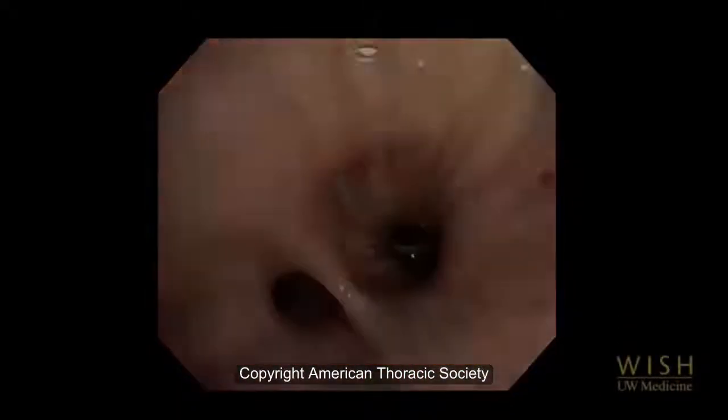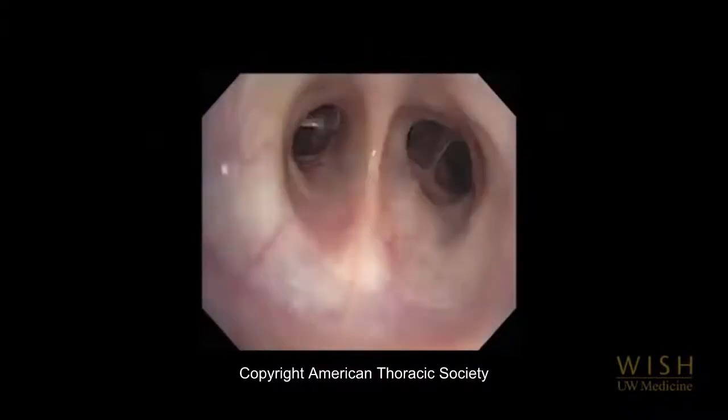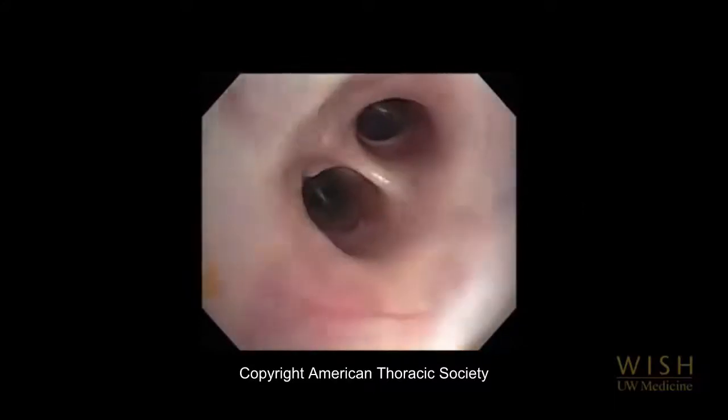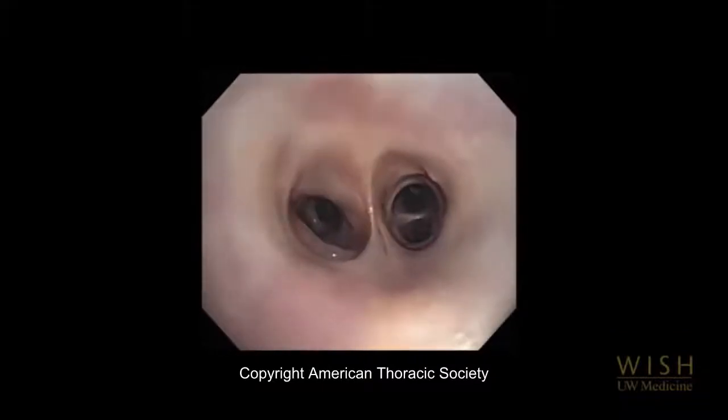We are continuing our anatomy demonstration in a different patient, where the inspection of the right medial basal segment has just been completed, and now we see how the right lower lobe bronchus then divides into the remaining basilar segmental bronchi, anterior, lateral, and posterior. Again, these are typically in a row when the bronchoscope is held in an anterior-posterior orientation within the right lower lobe bronchus, forming the familiar ALP mnemonic. These airways are inspected so that the subsegmental carina have been viewed, and then the bronchoscopy is complete.